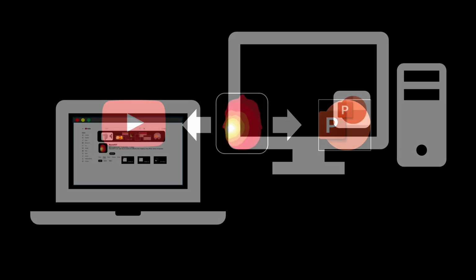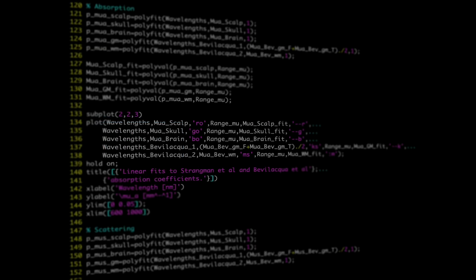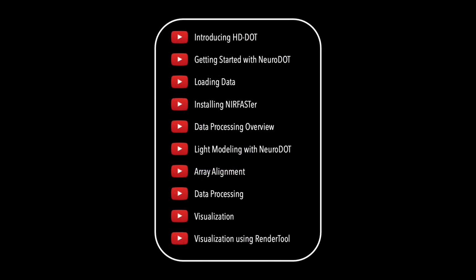The two resources are designed to complement one another, the videos providing background and context, and the PowerPoint presentations providing step-by-step self-guided exercises. These are typically paired with an M-file script that demonstrates how to properly implement a task using the functions provided in the toolbox. As the video series expands, deeper explorations of theory and computational issues will be included, but the emphasis of the initial selections are the basics.